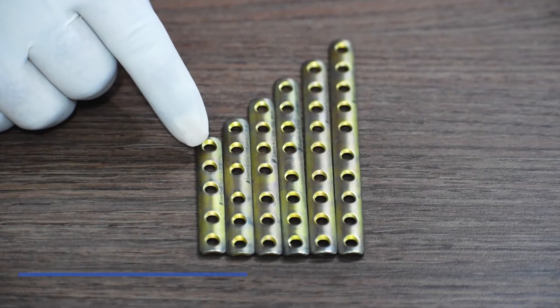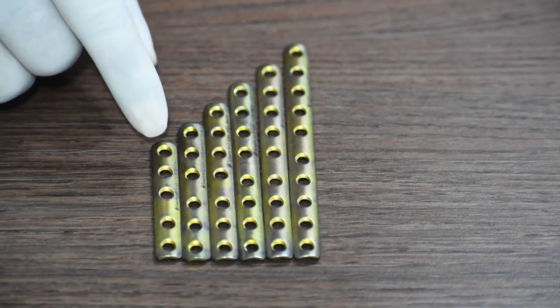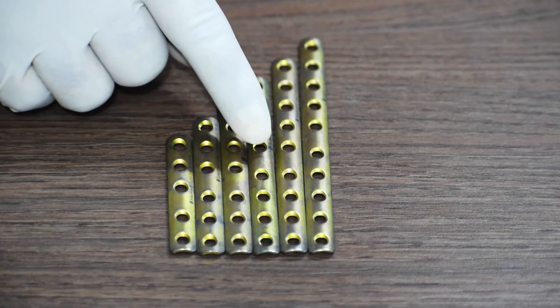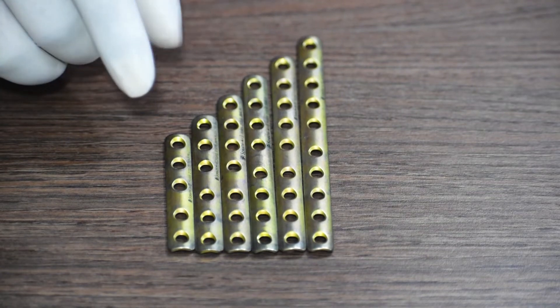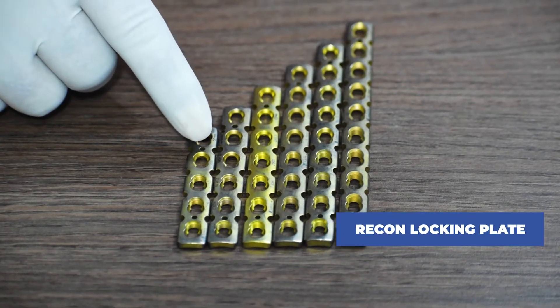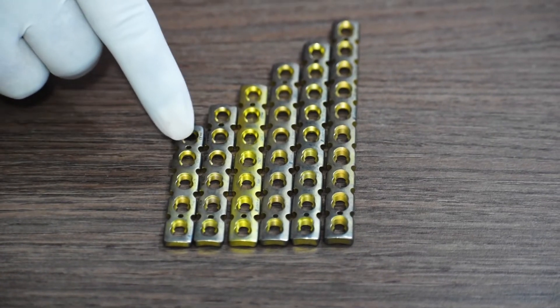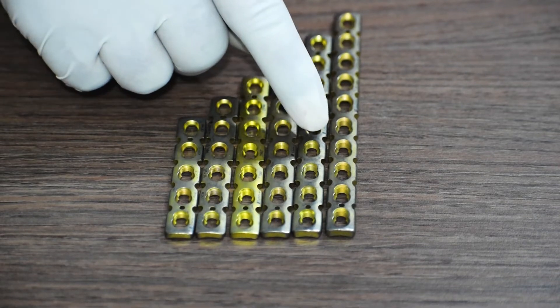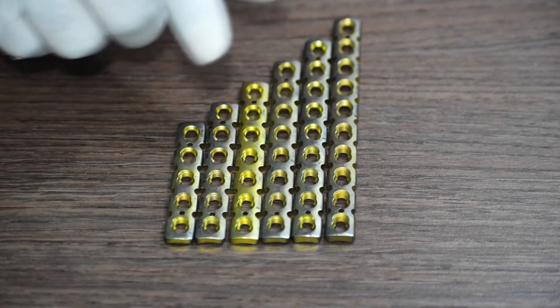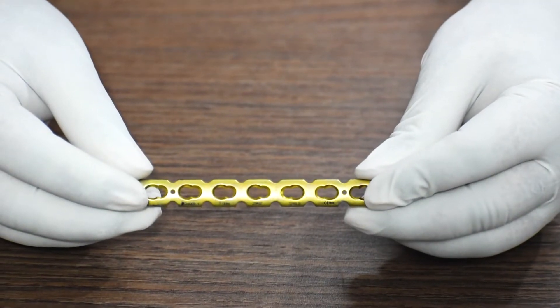This is the one-third tubular non-locking plate, similarly available from five hole to ten hole with one hole gap in between each plate — five holes, six holes, seven holes, eight holes, nine holes, and ten holes. This also comes in one set. For the recon plate, it comes with a combi hole.